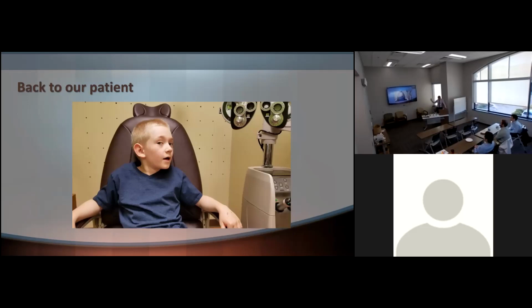Now, I was testing him. Interestingly, this patient had a null point also in convergence. When he converges, the nystagmus stops, and mom complained that he always holds stuff very close to his face. So I wanted to simulate convergence, not yoke prisms only.